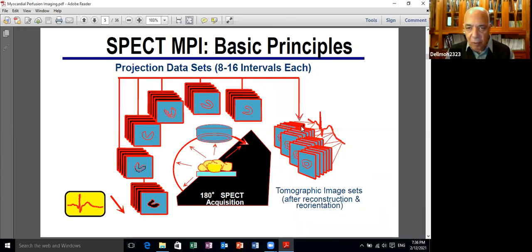And you repeat this for several hundred times. The reason we repeat it for several hundred times, usually 400 times, is that the noise is eliminated, because the noise varies from one cardiac cycle to the other, but the essential components of the picture stay the same. So you get more clarity of the picture, by adding the positive things and removing the noise or the extraneous confounding radiation. And then all these pictures are projected to an imaging matrix in the machine.